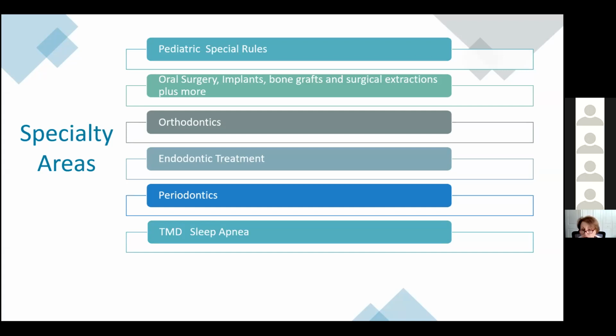I have oral surgeons who do third molar wisdom teeth extractions and actually will not extract without a CBCT scan, to make sure that when they are extracting that impacted wisdom tooth, they are not going to impinge on the nerve, so that the patient doesn't have that jaw numbness that relates back to that.